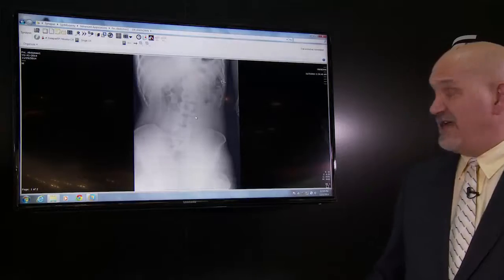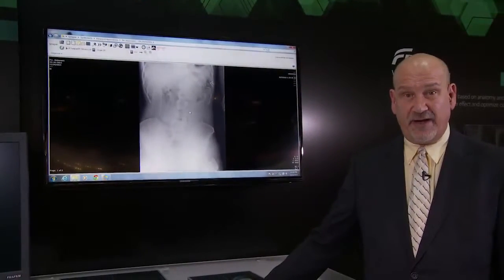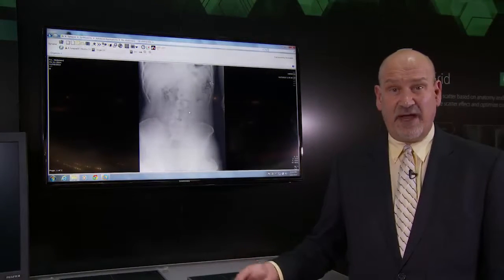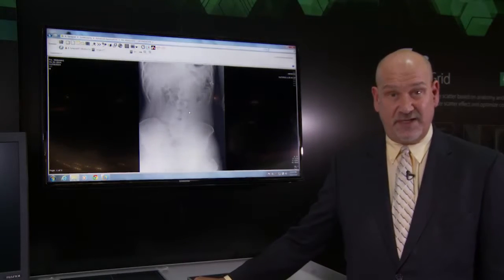This example shows an abdomen acquired without an anti-scatter grid. By virtue of being acquired without an anti-scatter grid, the contribution of scatter x-ray to this image is very large, significantly degrading image quality — particularly causing a great reduction in contrast and detail.